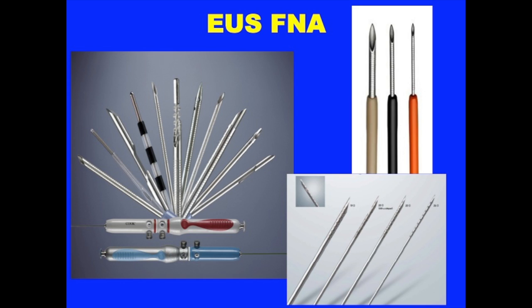For many of these, they are actually core needles, like this one from the Cook company, and they allow us to get more toward histopathology, so it can be more helpful. And I think this will play a role too as we become more focused on the responsiveness of patients' tumor to different types of chemotherapeutic agents, and we become more designer as they have, for example, in lung cancer.